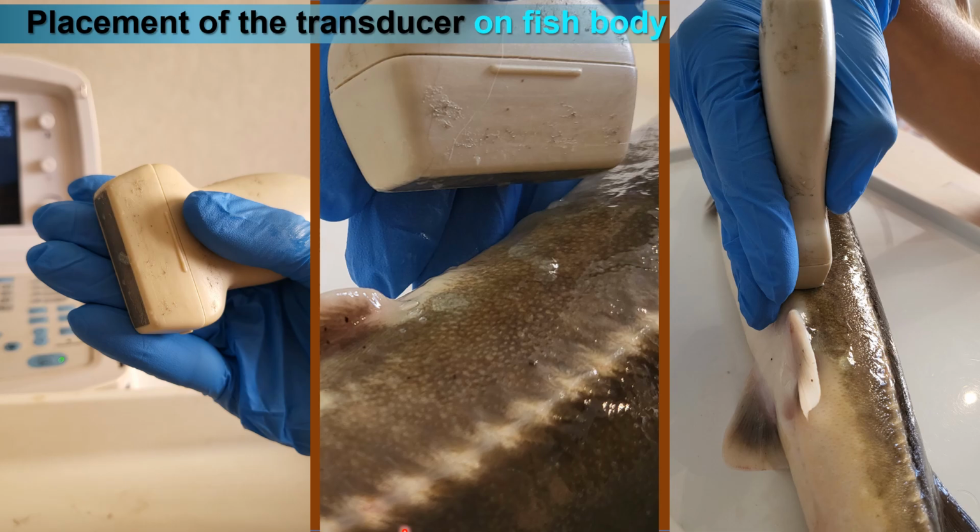Let's move on to the practical aspects of placing the transducer on the fish body. If you do not have any experience in ultrasonic diagnostics, the best option for the initial placement of the transducer may be as follows. The fish is laid on its side, ventral side out.